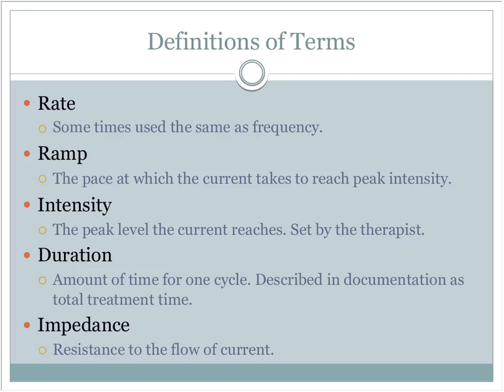Important to keep in mind, though, that the intensity from one day to the next for the same exact treatment may never be the same. This is influenced by many, many factors. A lot of times I'll have patients say, okay, yesterday when you did this, I was on 15, so let's see if we can't get to 18 today. And I have to let them know that that has absolutely nothing to do with the effectiveness of the treatment.